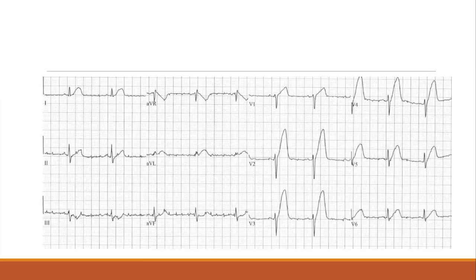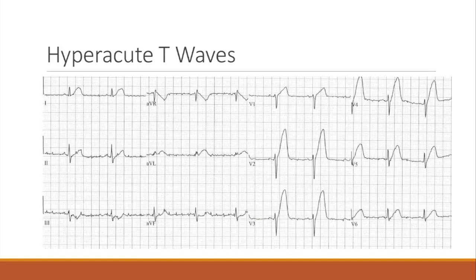Big T waves — big T waves, right? This is not a left bundle because the QRS is narrow. So what's the differential diagnosis for big T waves? Hyperkalemia, and probably also coronary artery occlusion considering the presentation. So these are hyperacute T waves.